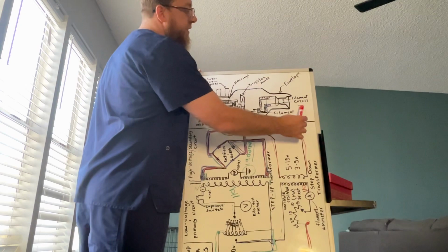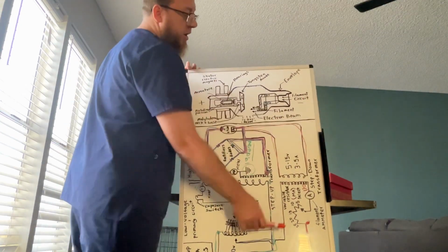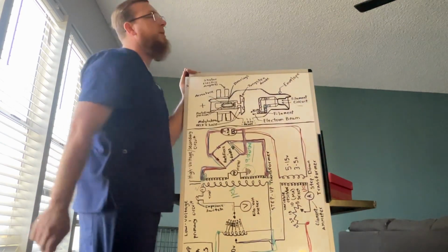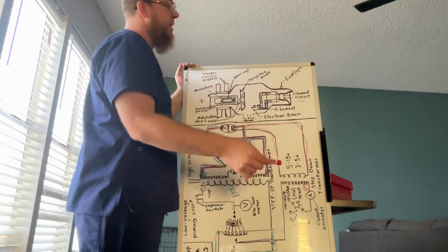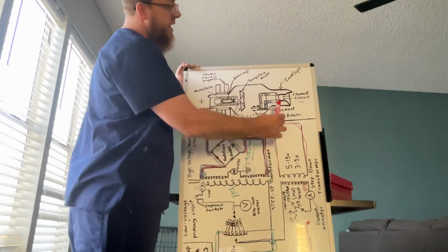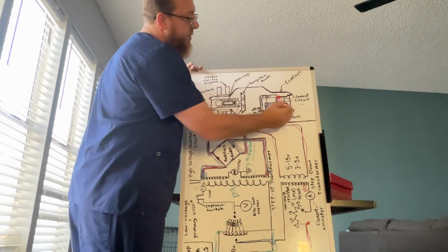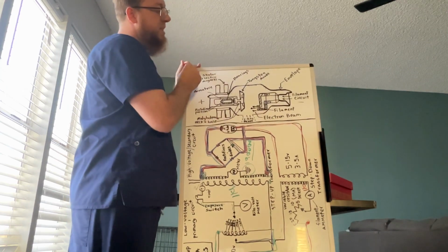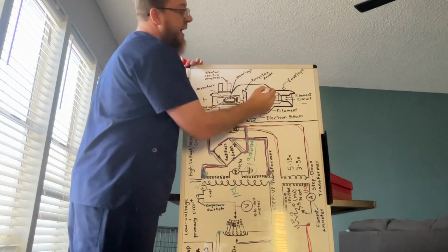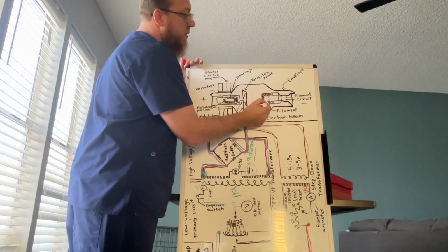We're going to come over to our filament circuit. Once all this is happening, our filament circuit is going to start creating electrons, an electron cloud, and thermionic emission. And I'm going to explain. Here we have our filament, and here we have our focusing cup. And our focusing cup is going to have electrons that are surrounded on the outside, like so.